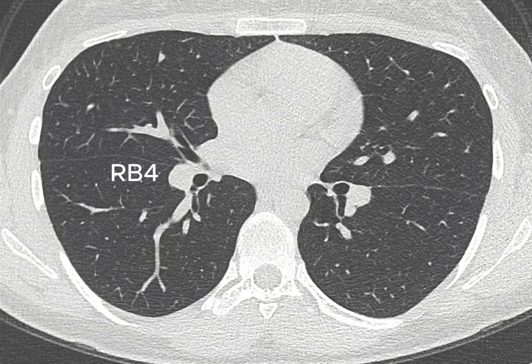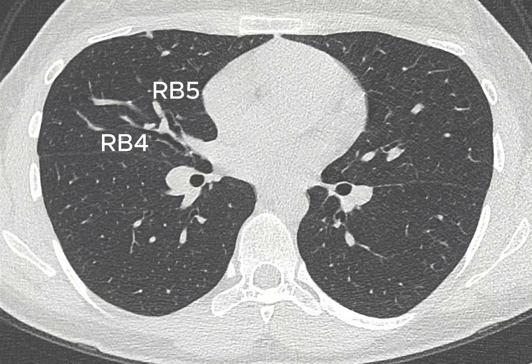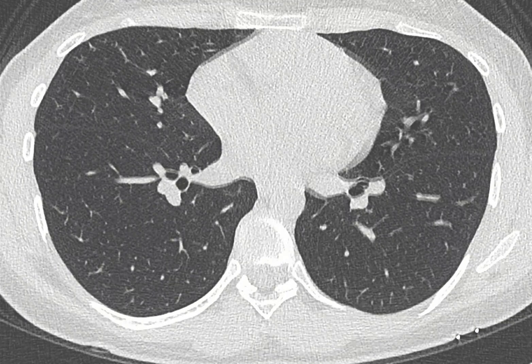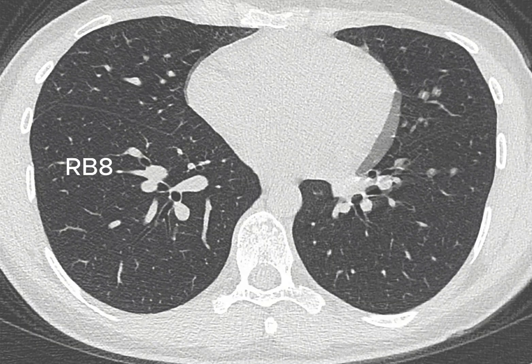Then we continue to the middle lobe bronchus, which bifurcates into the RB4, the lateral segment, and the RB5, the medial segment. Traveling into the lower lobe bronchus, we can identify the RB7, the medial basal branch. And finally on the right side, we can identify the RB8, the anterior basal segment, the RB9, the lateral basal segment, and the RB10, the posterior basal segment.